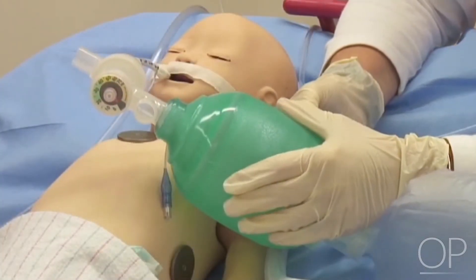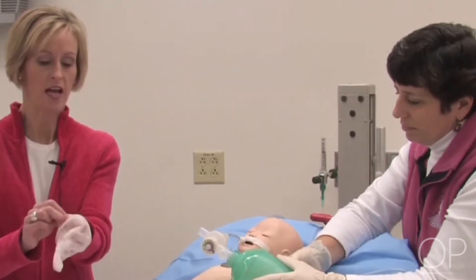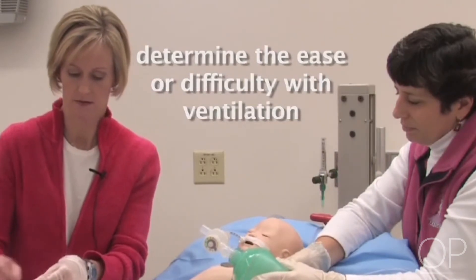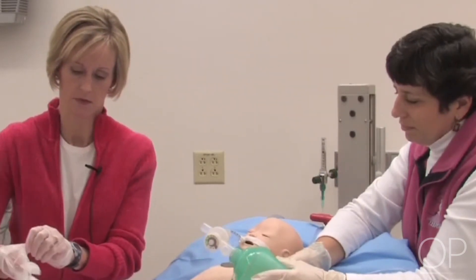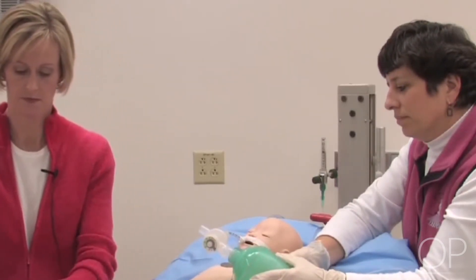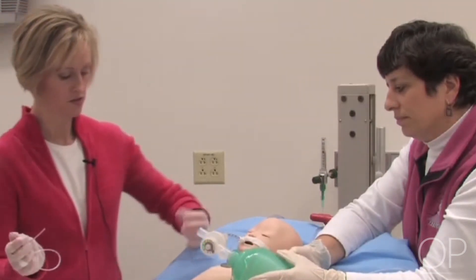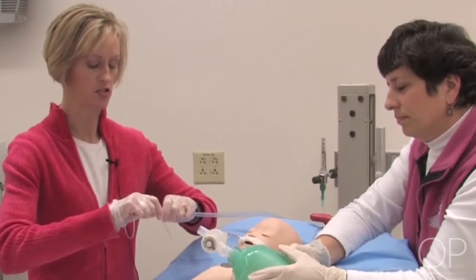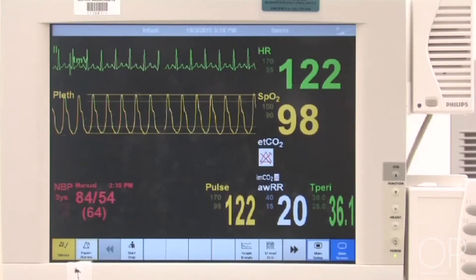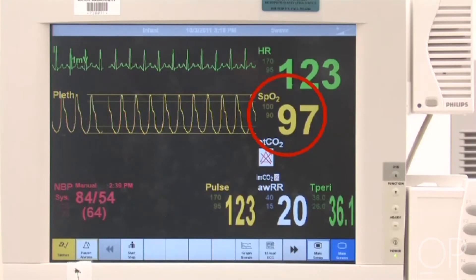At this point, we can observe the presence or absence of secretions in the tube, and we can determine any difficulty with bagging the patient. I'm going to maintain one sterile hand and use this hand as my dirty hand to connect my suction. We would also observe our oxygen saturation and other vital signs to make sure that we're stable prior to starting the procedure.